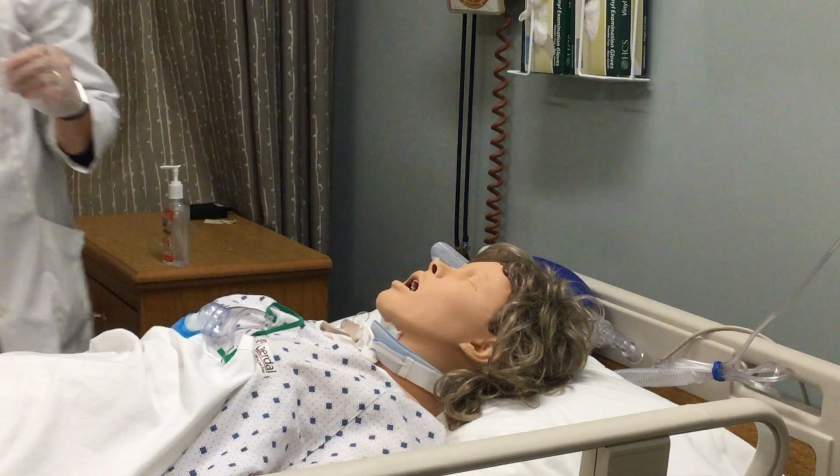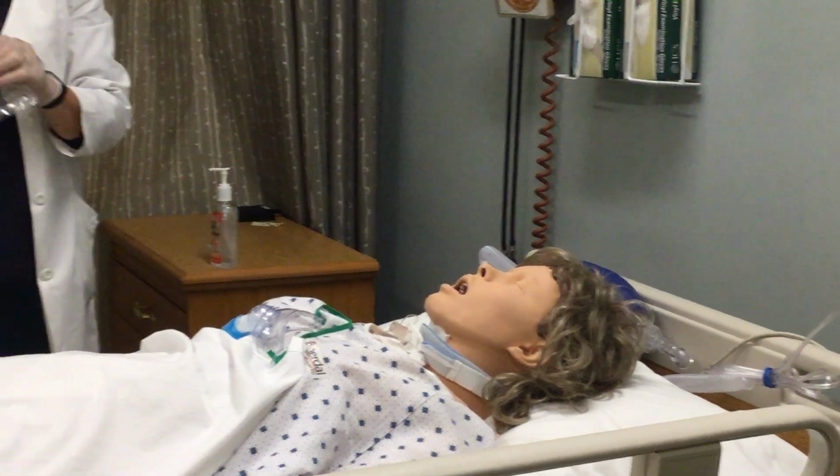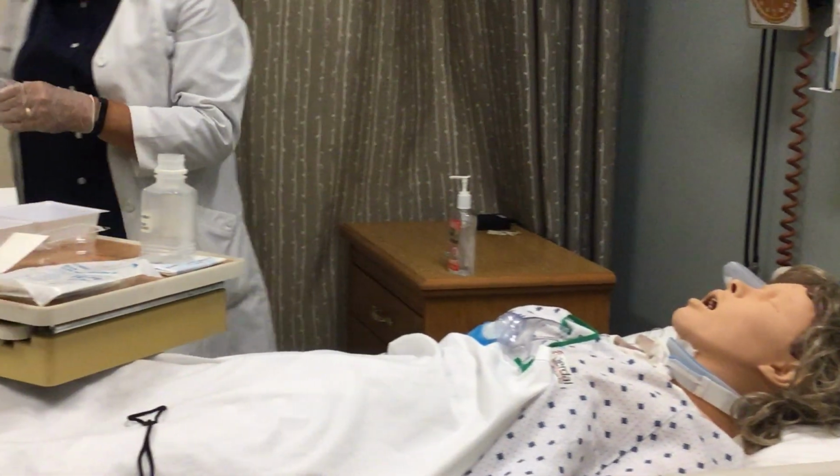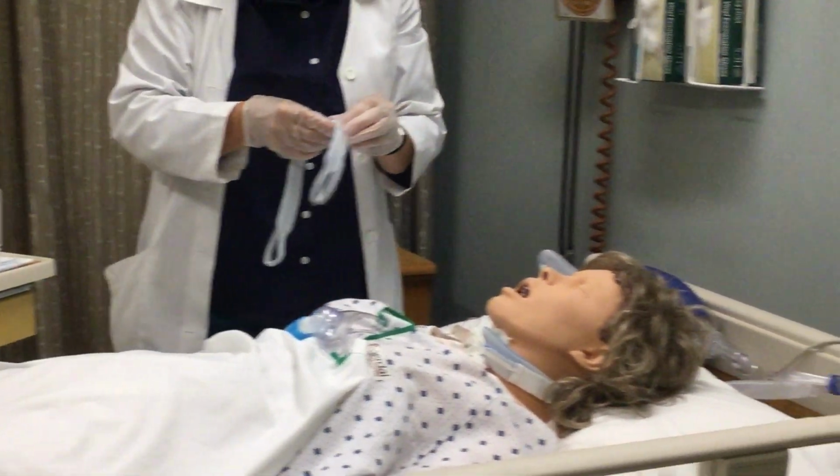You can either use the prepackaged twill tape, or what many hospitals now use are the prepackaged Velcro disposables, which are quite nice. Today, I'm going to show you how to use the prepackaged Velcro.